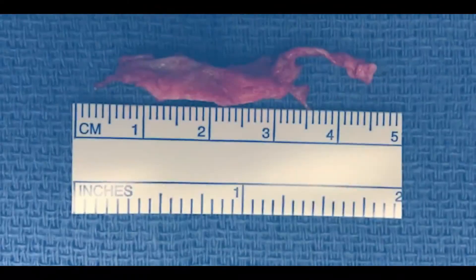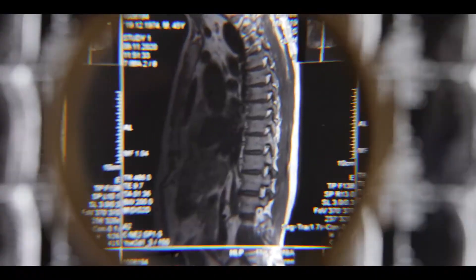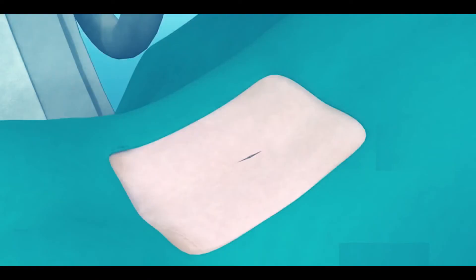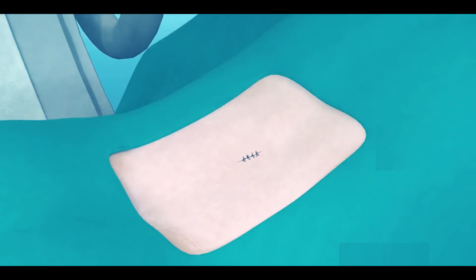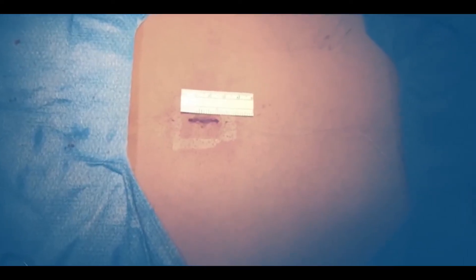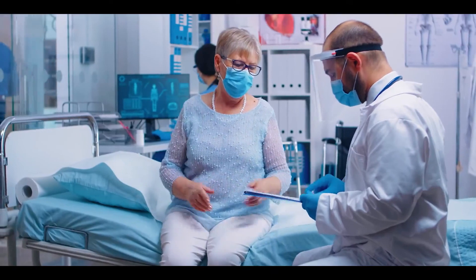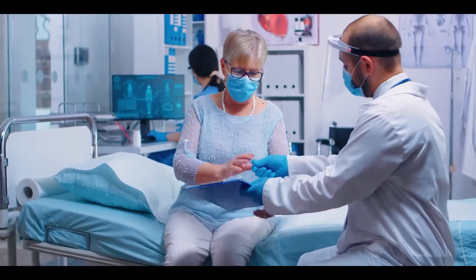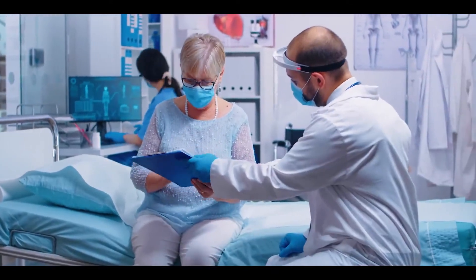Once the surgeon removes all parts of the protruding disc and ensures that nerves and muscles are not damaged, he sutures the deep fascial and subcutaneous layers and uses special surgical glue to close the wound without bandage. After successful surgery, most patients are discharged the same day after a few hours of hospital stay.